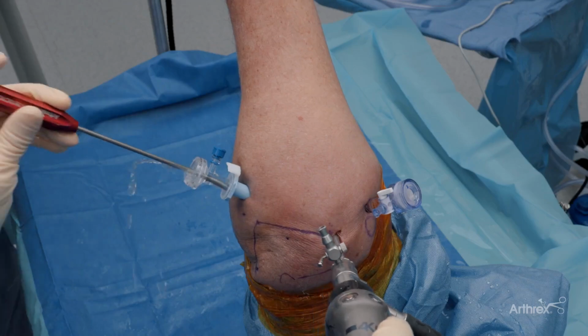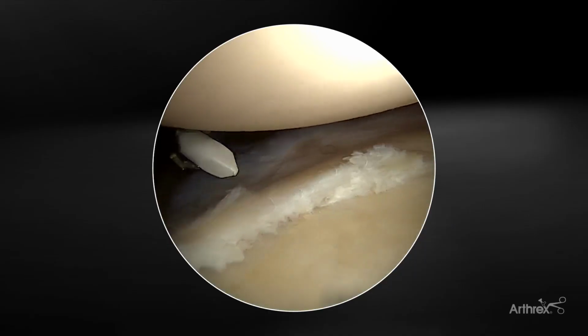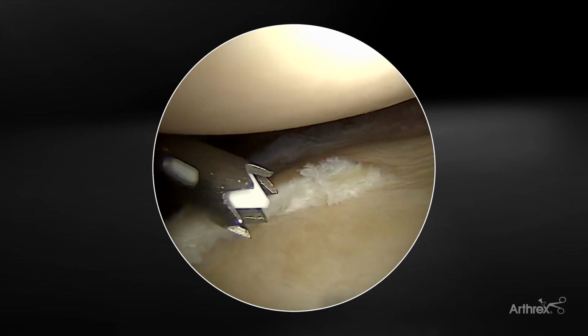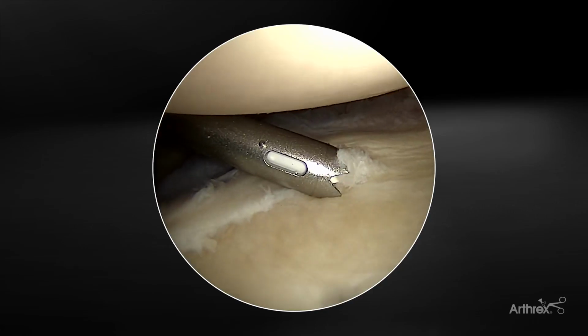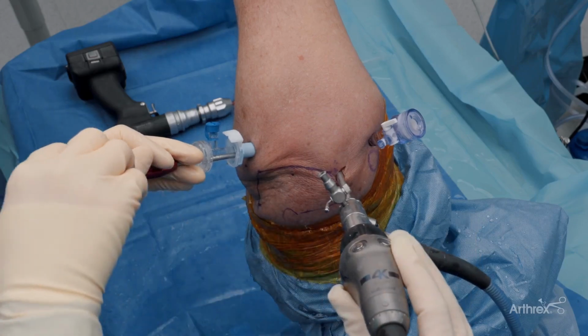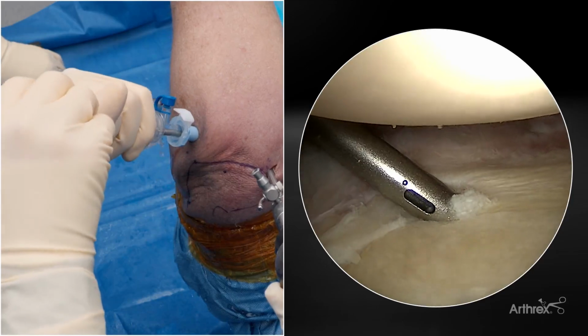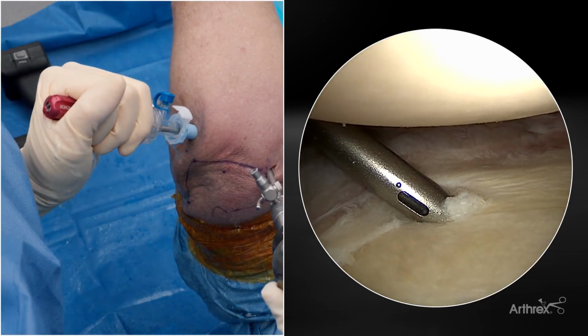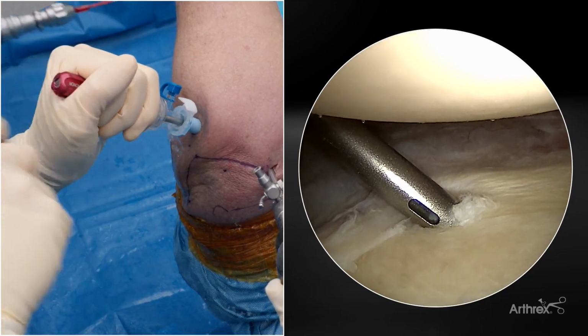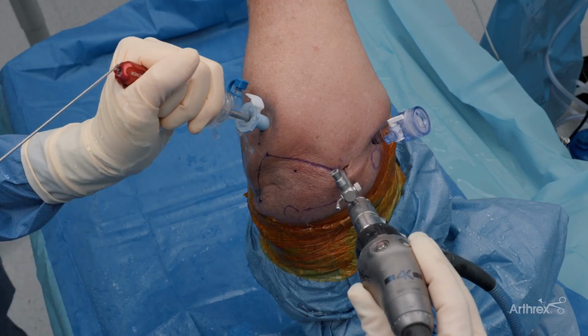We're going through this posterior cannula here, and I'm going to use a mallet to tap this in place once I get it where I want. I like holding the camera as I get this here, and then I'm going to hand the camera off so that I can have two hands on this part, because you can see where I have this. I'm going to use this now, and I'm going to push the humeral head forward and then just tap this into place. We don't want to skive as we bring this across.